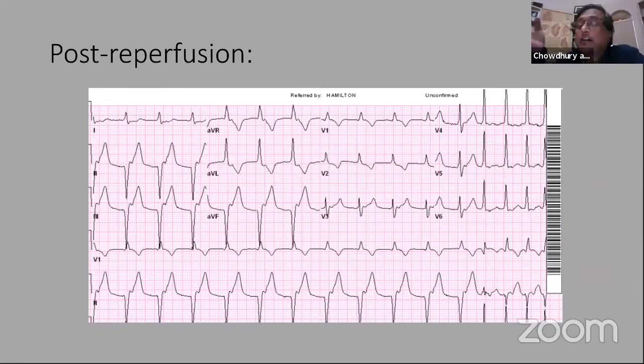The other arrhythmias that can be present, because this is a patient with particularly inferior infarction. I had one patient about a week ago where the patient went into cardiac standstill. Only P wave, no QRS. I don't know why, and I've looked into this. If the patient is conscious and you tell the patient to cough, cough, cough, this rhythm comes back. What the mechanism is, I would be happy to hear. In the meantime, we give atropine and get ready for the temporary pacemaker, but the patient came back.